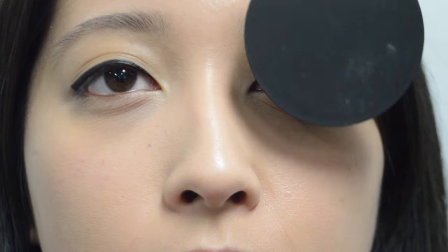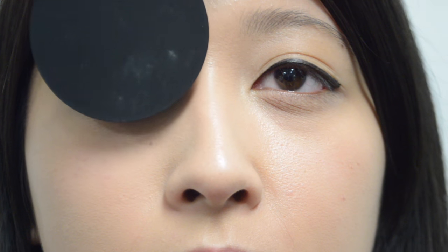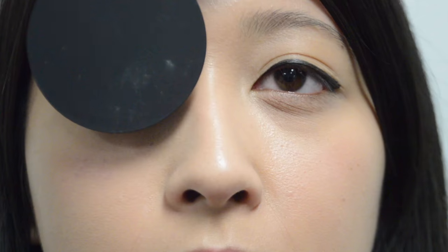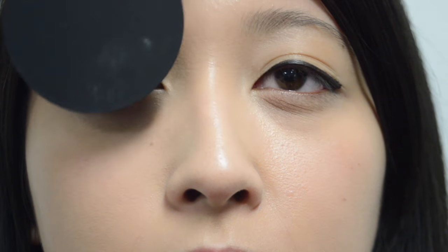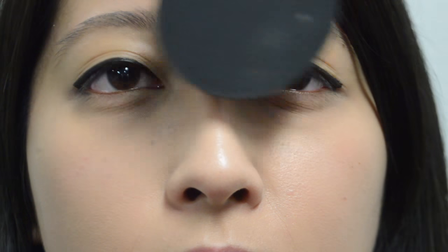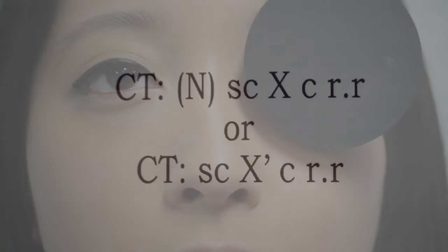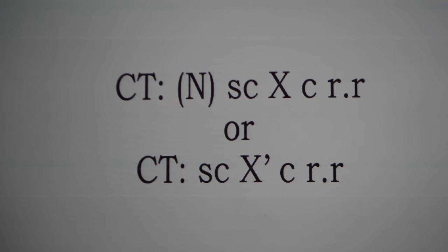This is the cover-uncover component of the cover test. This is the alternating cover test. From the cover test, you can see that Trissie has an exophoria with rapid recovery. These are two different ways to record it.